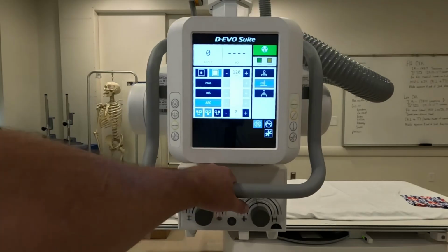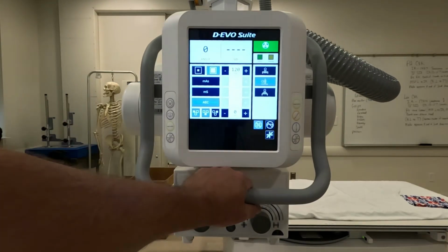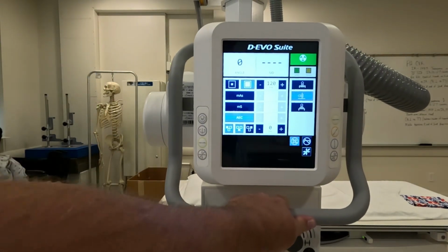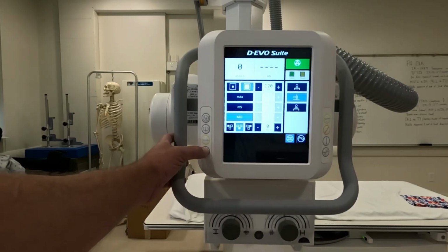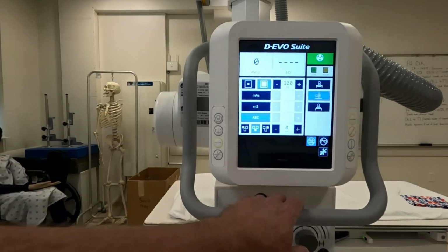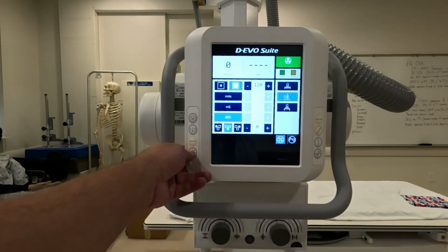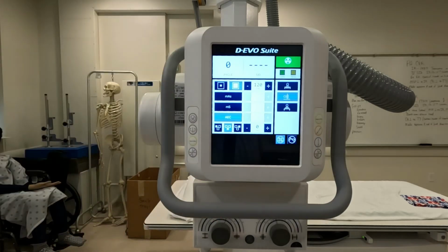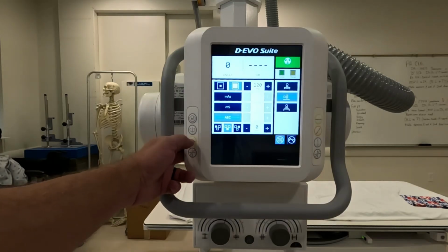So what you'll see on your X-ray tube, and on this one specifically, is that it's got a kind of biometric control on this handle here. If you touch it, it'll move pretty much anywhere in the room that you want it to go. So you've got that. If you see a button that looks like an asterisk, that does essentially the same thing as just grabbing this thing, and it will take it pretty much anywhere you want to go. Not real sure why the Fuji system has both of them, but it doesn't really matter either way. It is what it is.